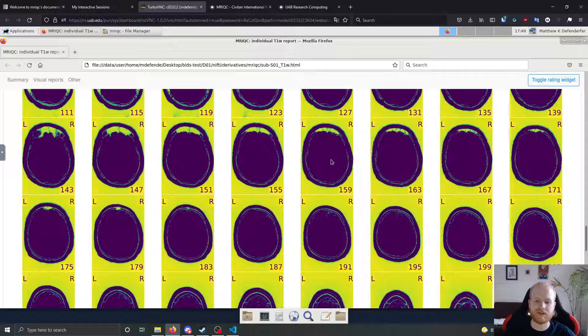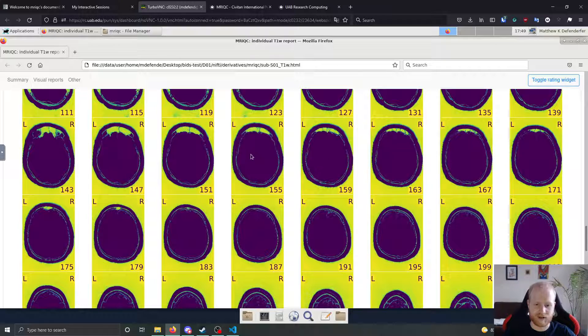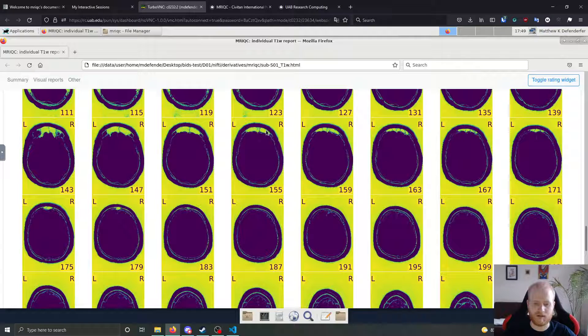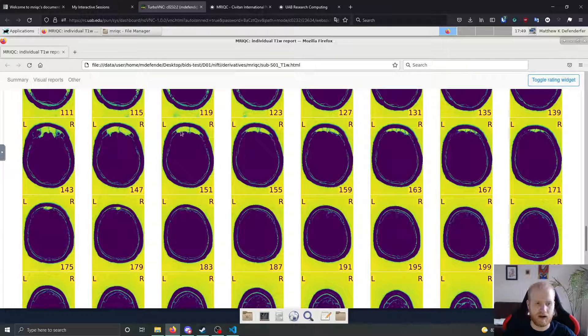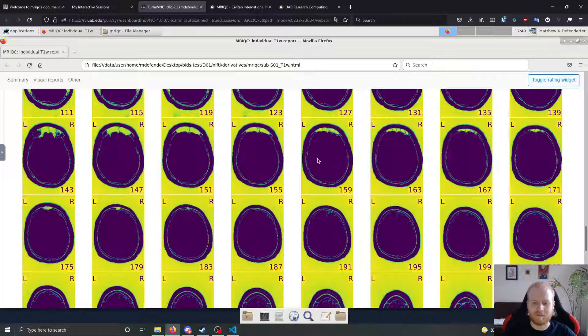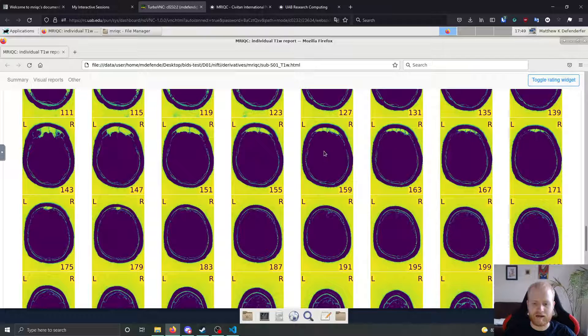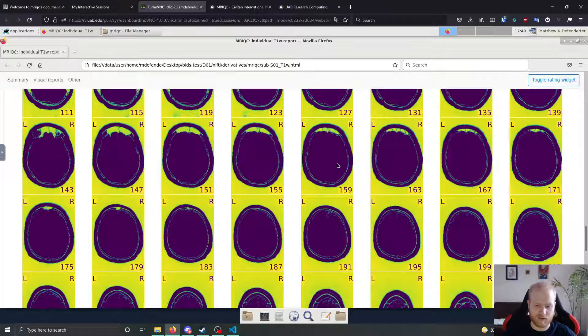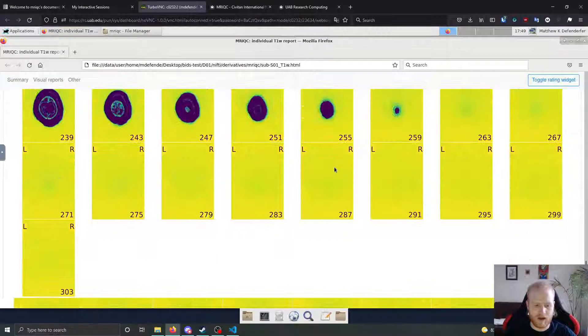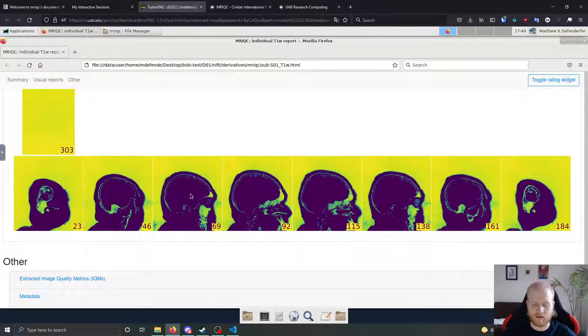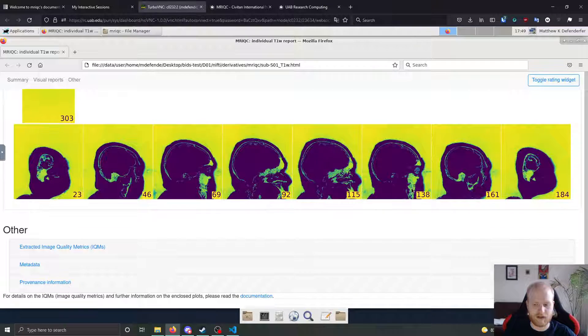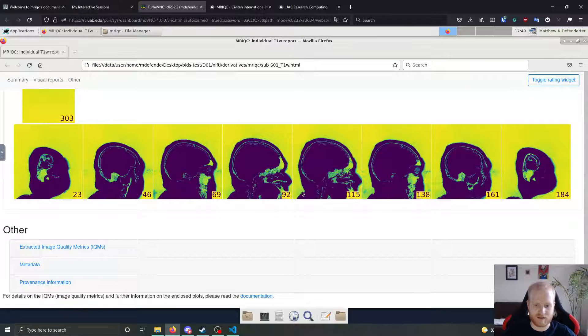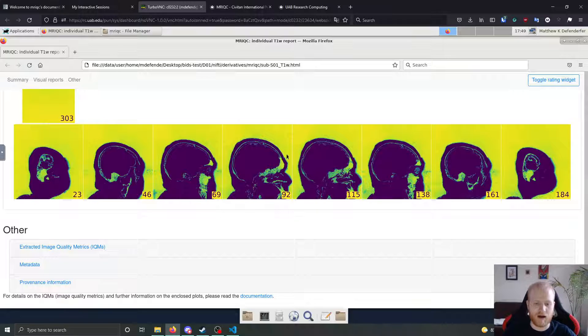But whenever you get into the brain itself, you don't really want to see any noise whatsoever. You want this to be pretty much all purple. And that's what we see for this subject here. You can see the outline of the front of the brain next to some of the sinuses up here, areas of high noise, but the brain itself is very low noise overall. So that's really good. Same thing for the sagittal views over here, areas of the brain itself is very low noise. Everything else can be high noise. It doesn't matter. But the brain itself is low noise, which is great.